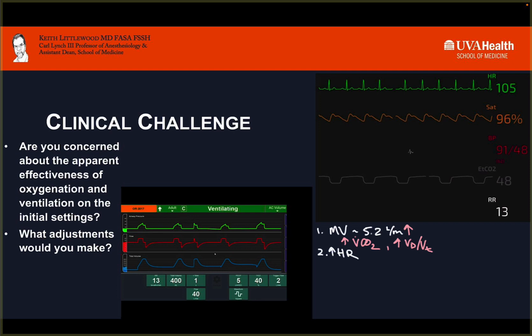In terms of saturation, if we think about something called the PF ratio, which is commonly used in our hospital in the ICUs, or some variation thereof, that's just the PaO2 over the FiO2 as a fraction. So we have to, again, we're not going to draw a blood gas. We have to guesstimate what the PaO2 is. And it's maybe in the range of say 100. Let's use that as a guesstimate.